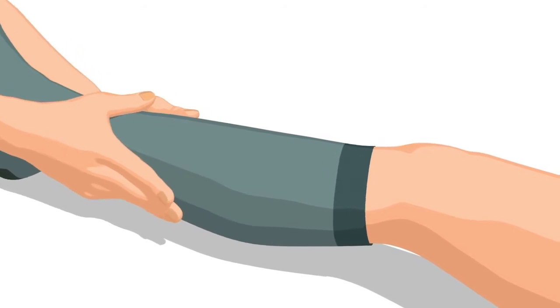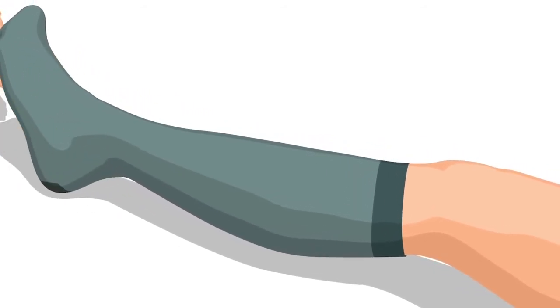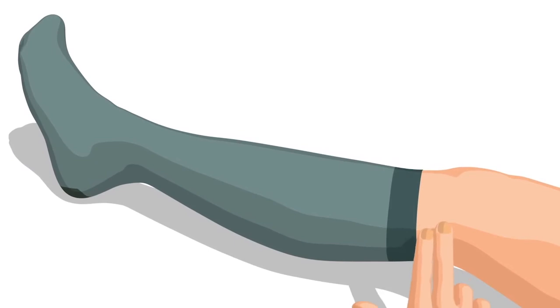Smooth out any excess fabric, there mustn't be any wrinkles. Ensure the top band is flat and not folded over. It should sit 2 finger widths below the crease at the back of the knee.